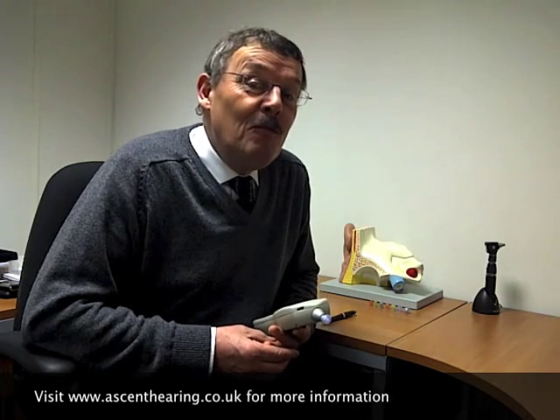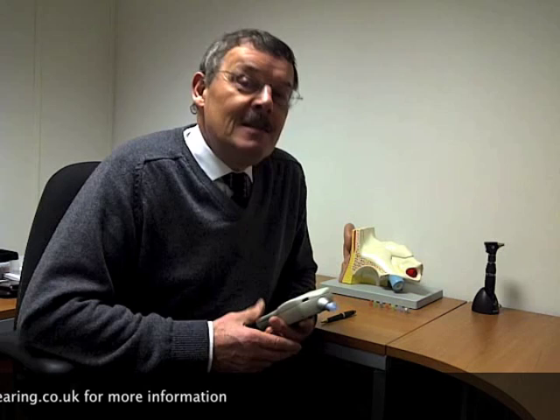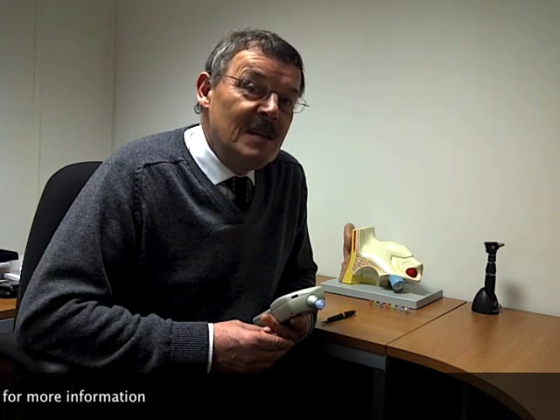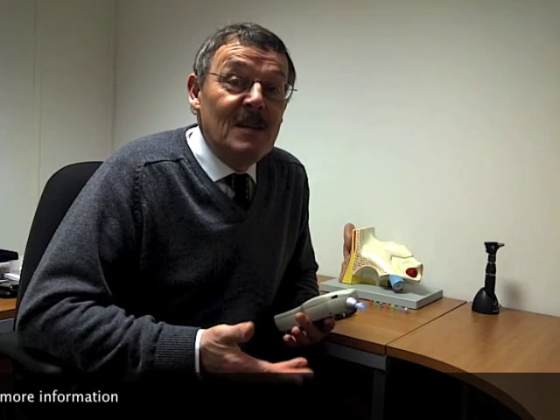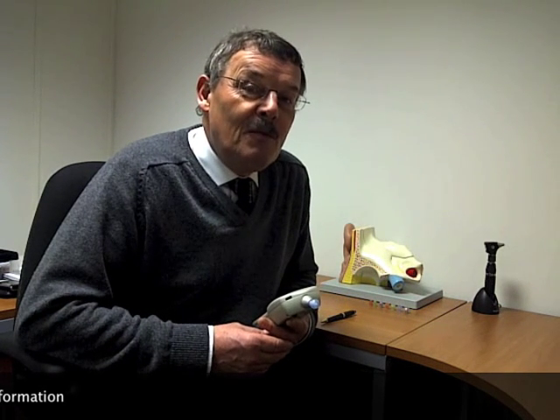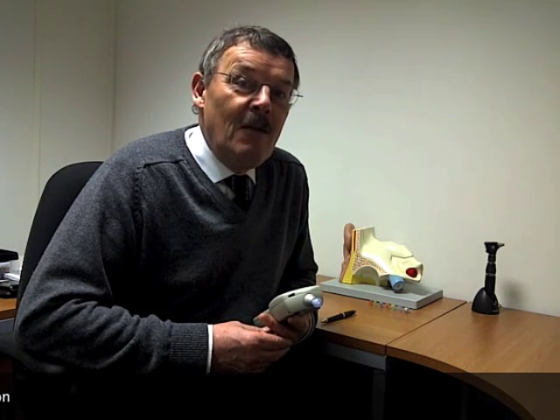There are cases, funnily enough, where you might get a little bit less stiffness, and that would be, for example, where there's been a break in the ossicular chain. So the eardrum is very flaccid, and that could be caused by, say, a road traffic accident where there's been a blow to the head. But whatever, we have the kit to be able to make measurements of how well that part of the ear works, whether the stiffness is within normal limits or whether the stiffness is higher than normal, in the case, for example, of an ear infection, or possibly lower than normal, where I gave you the example of the broken ossicular chain. And in the next bit of video, I'll be showing you the kit and how that measurement is made.